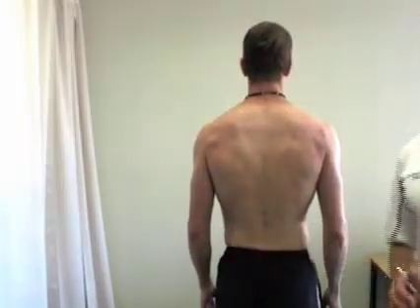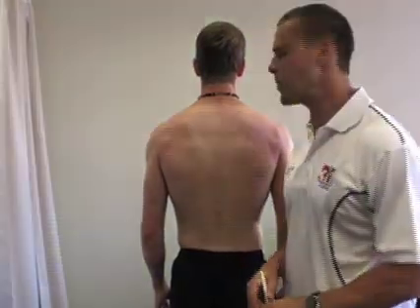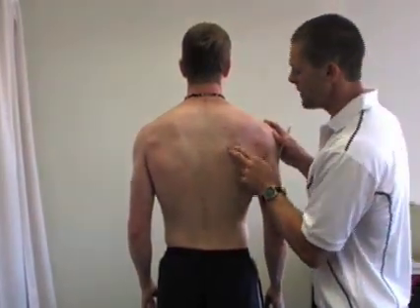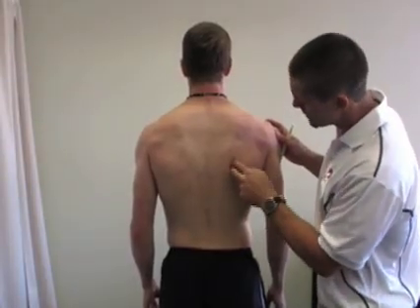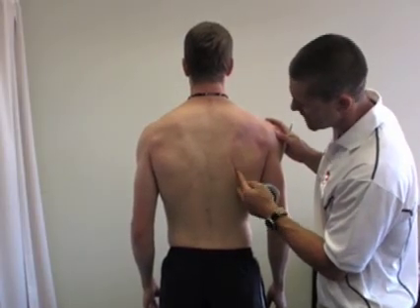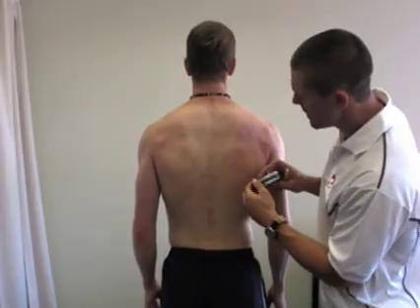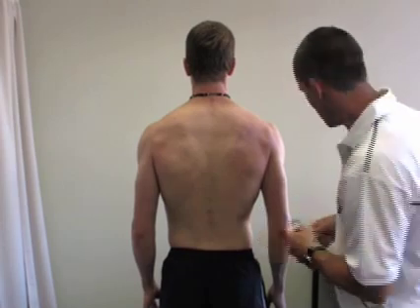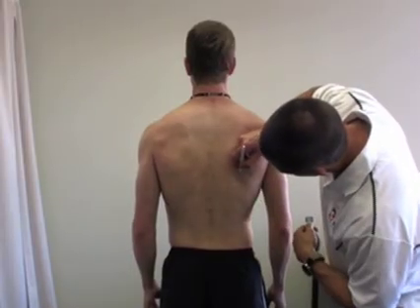What we're looking for here is the subscapular — as the name implies, it is sub or underneath the actual scapular bone. We palpate to find the inferior angle of the scapula. Simon's scapula goes along here, comes down, and that's the inferior angle. We need to measure 10mm below that particular point to locate the skinfold site, which is just there.